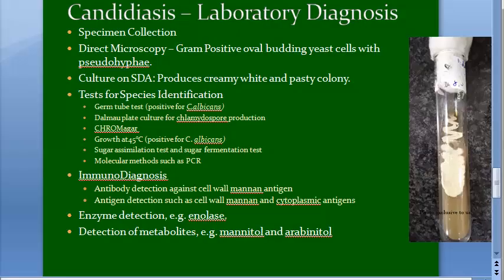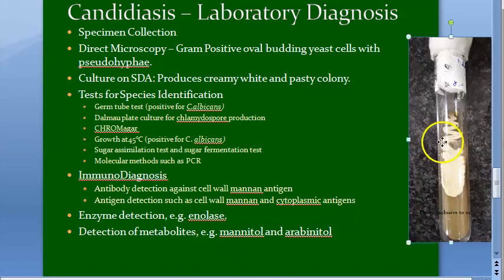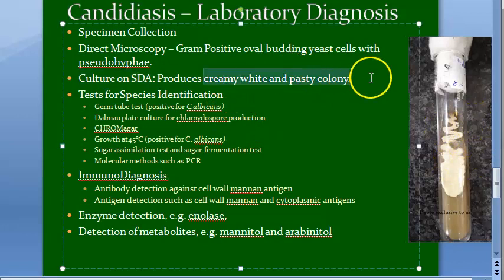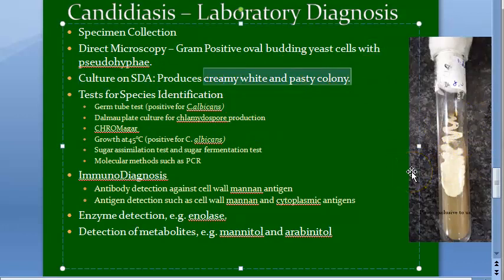Welcome. In this video we want to look at the candidiasis lab diagnosis. This SDA agar was used to grow Candida, and this is how it looks — creamy white pasty colonies. Let us look at the complete lab diagnosis of candidiasis.